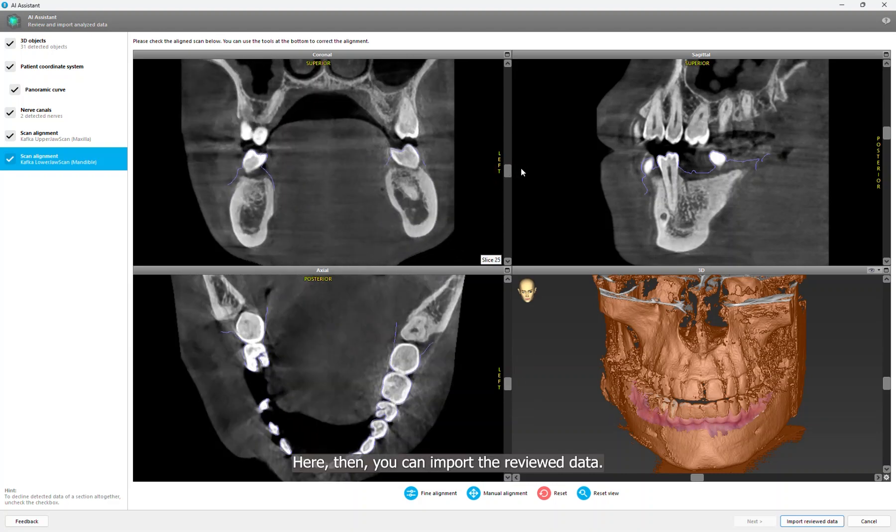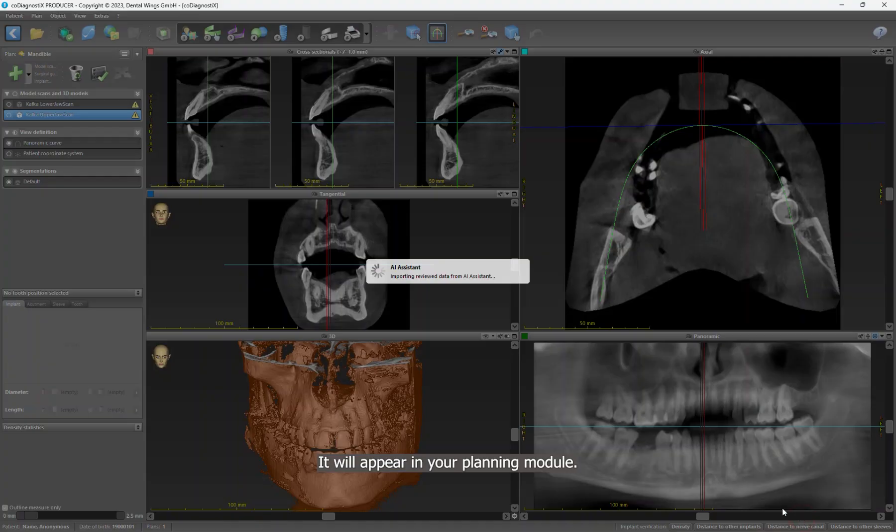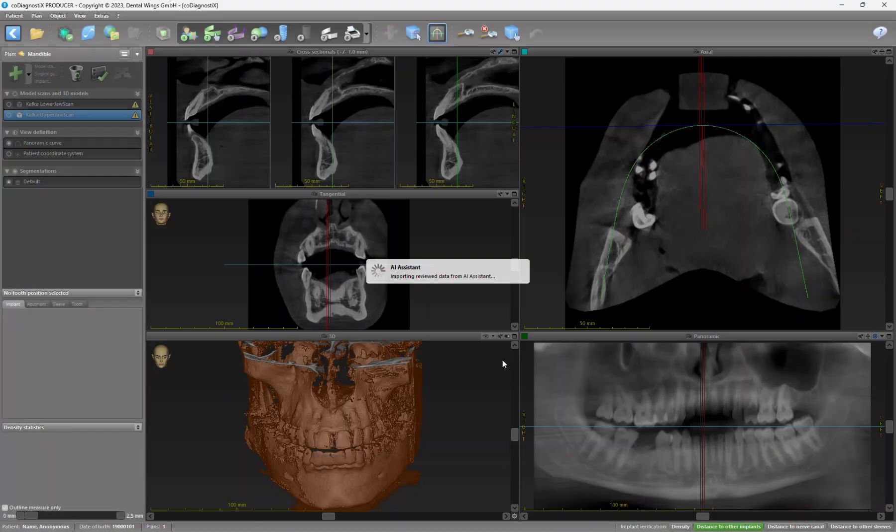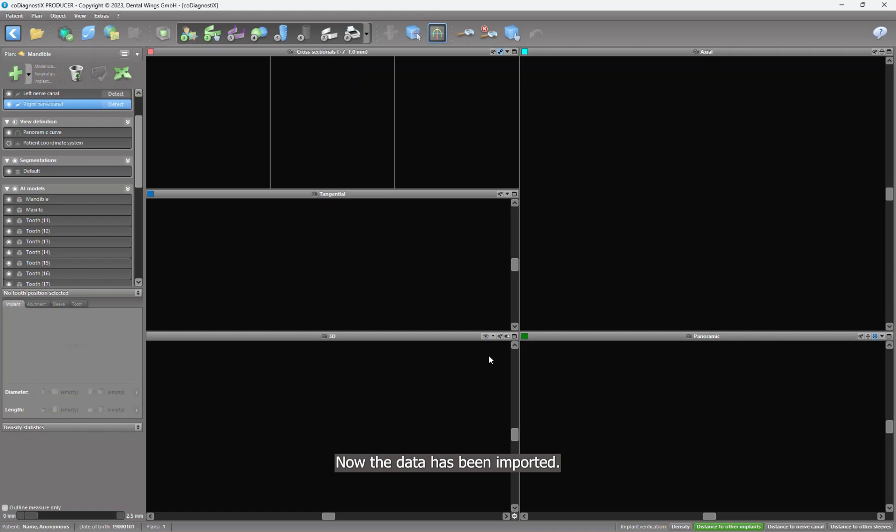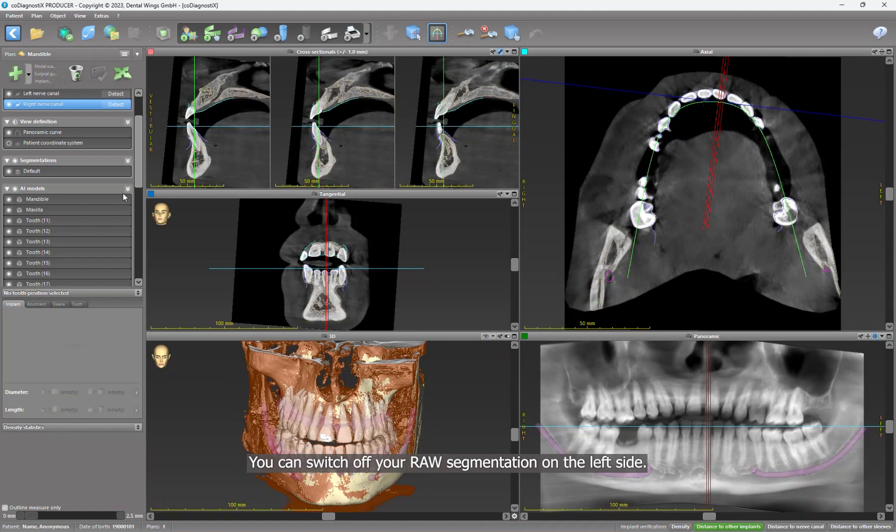Here, then you can import the reviewed data. It will appear in your planning module. Now the data has been imported. You can switch off your raw segmentation on the left side.